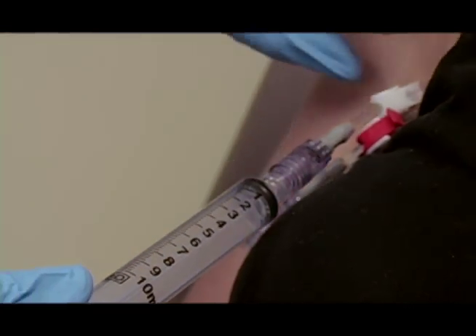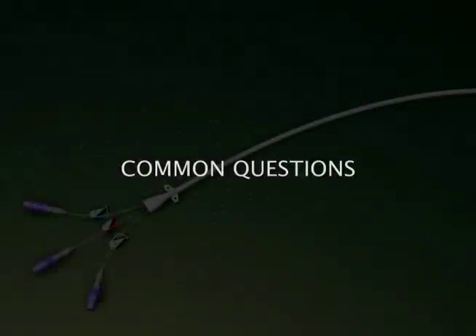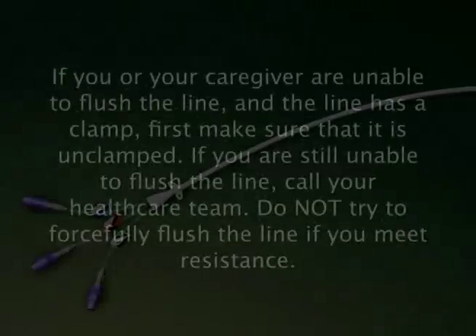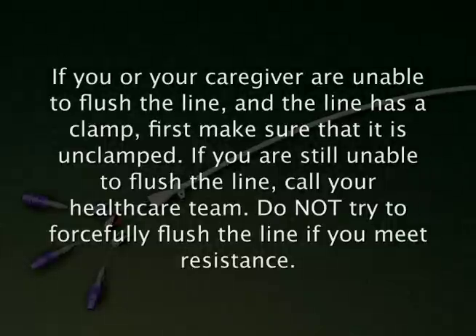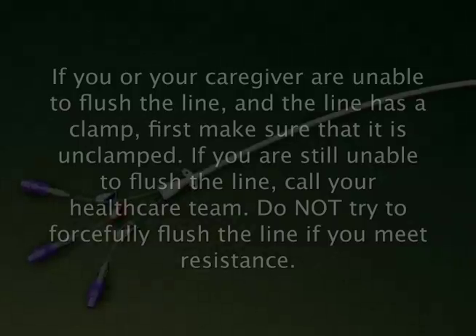These are normal sensations. Some common questions that patients have include: what if I have difficulty flushing the line? If you or your caregiver are unable to flush the line and the line has a clamp, first make sure that it is unclamped. If you are still unable to flush the line, call your healthcare team. Do not try to forcefully flush the line if you meet resistance.